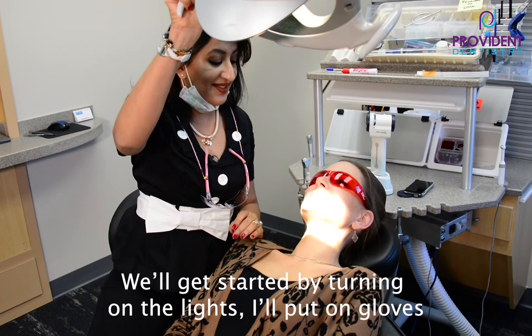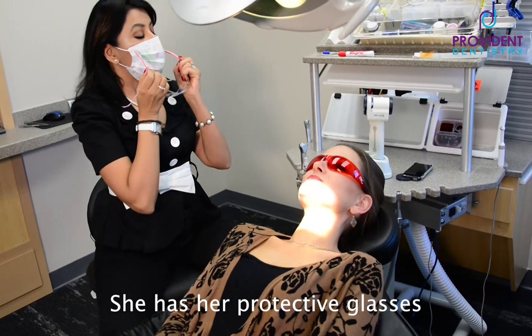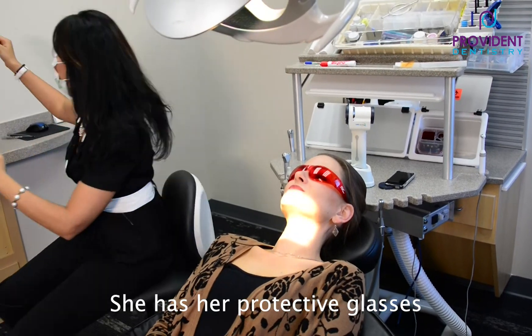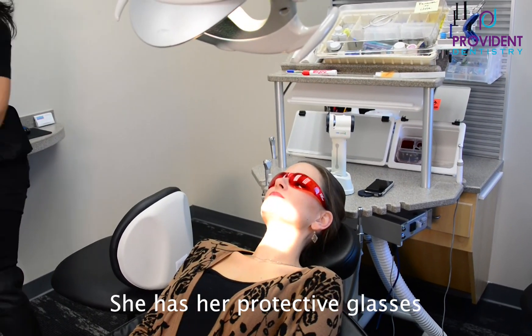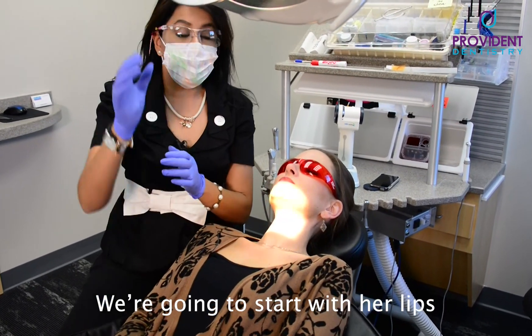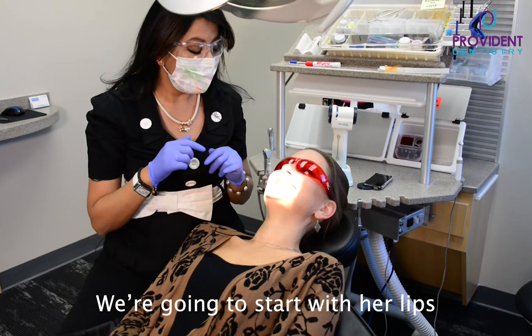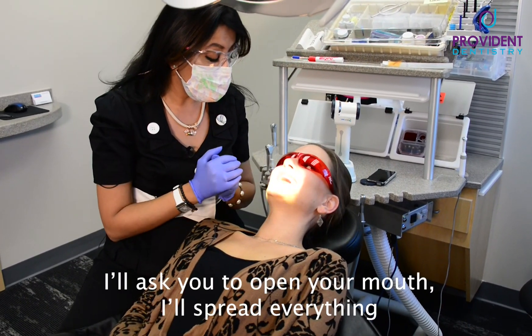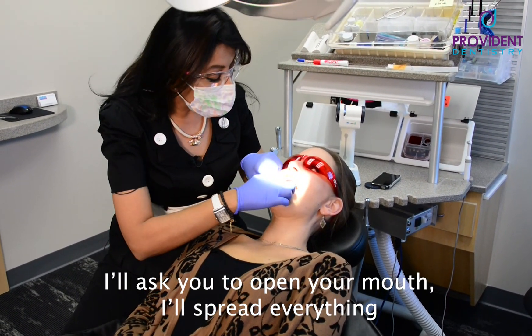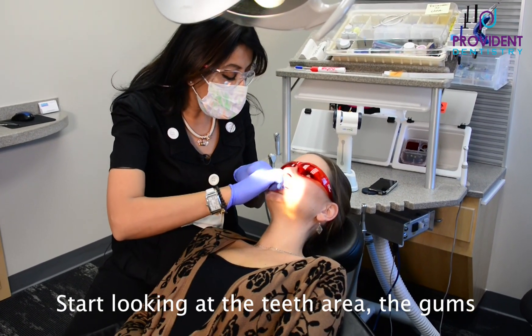Let's get started by doing the basics. I'm going to turn the lights on, get some gloves on. She's got her protective glasses. I'll start with her lips — she's got lipstick, so pretty good, nice color. I'll ask you to open your mouth for me, please. Brilliant. I'll spread everything and start looking at the teeth and the gums.